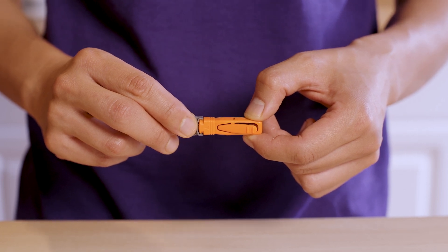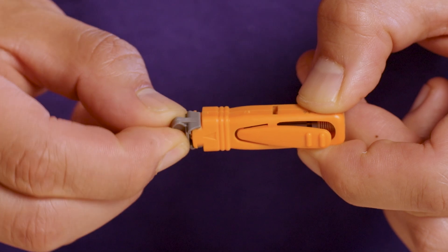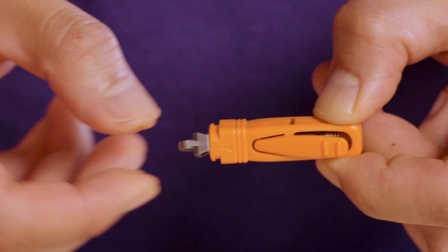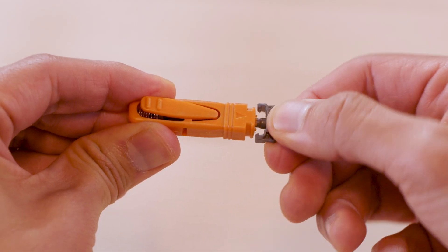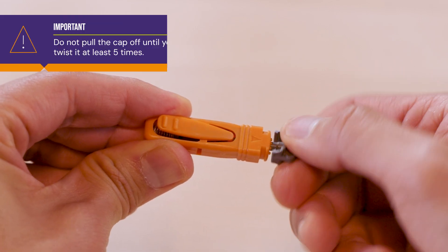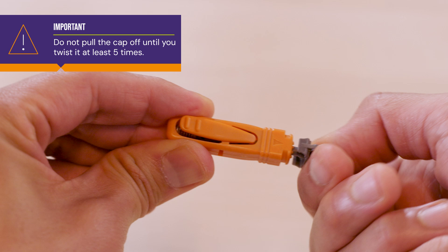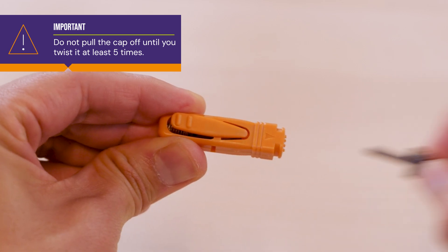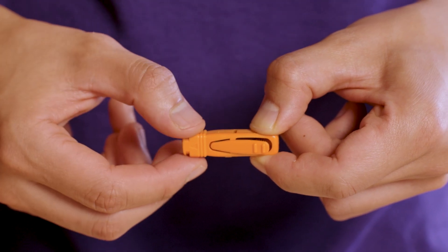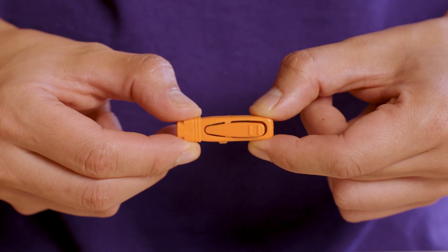Hold the lancet by the flat sides, avoiding the release tab. Twist the gray cap a quarter turn to unlock it. Then twist it five or six more times in the same direction to loosen it. Once unlocked and twisted, gently pull the cap outward to remove it. Be careful not to press the release tab just yet. The lancet is now ready for use.